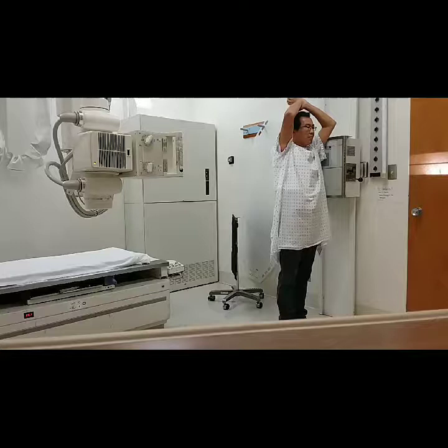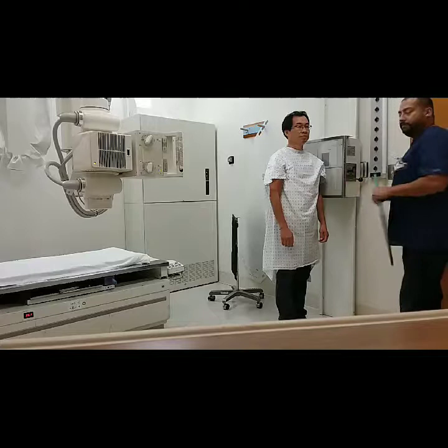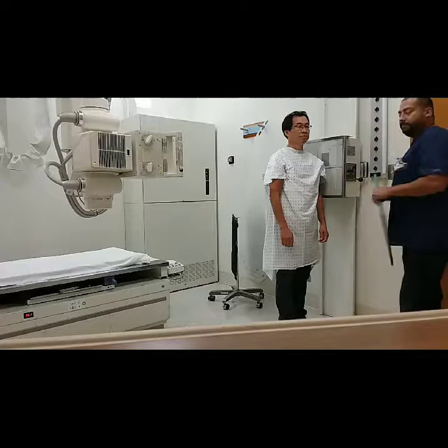Mr. Chen, two deep breaths — hold it. X-ray. Go ahead and relax, Mr. Chen. We are all done. I'll have our patient relax while I develop this image to make sure everything is good, and if we're good, our patient is all done.